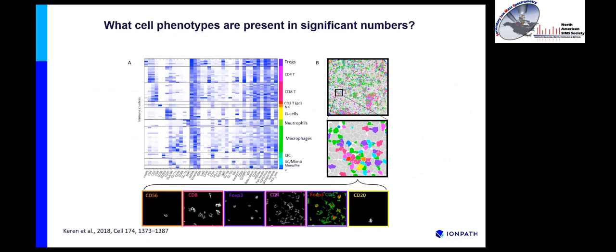And so every example I'm going to show follows that same workflow I talked about earlier, where we stain, we image, then you segment the tissue image into individual cells, and then you classify those cells as positive or negative for particular cell types; you do cell phenotyping. And so we can see here, at the high level of all of the samples included, the cell phenotypes that are present throughout these samples. Here they're doing a little bit of a drill down into one of the phenotyped images and looking at the expression that led up to that.